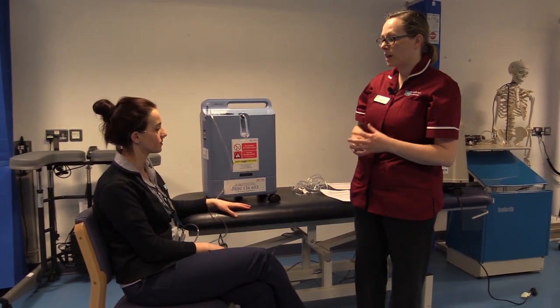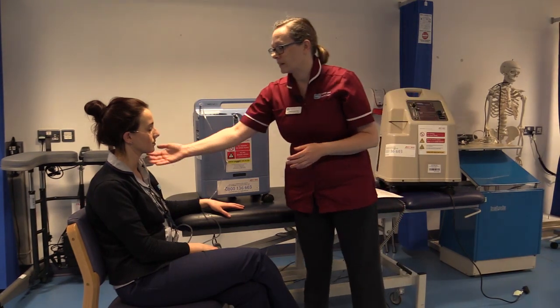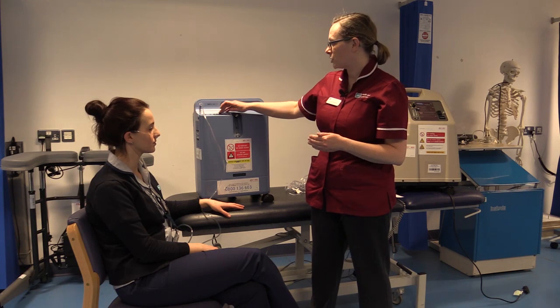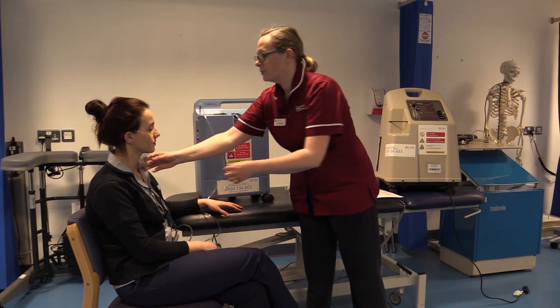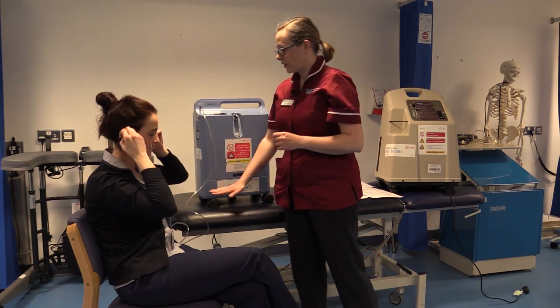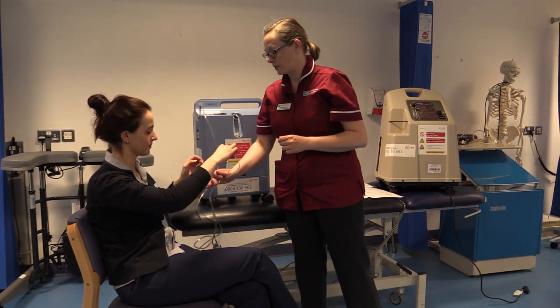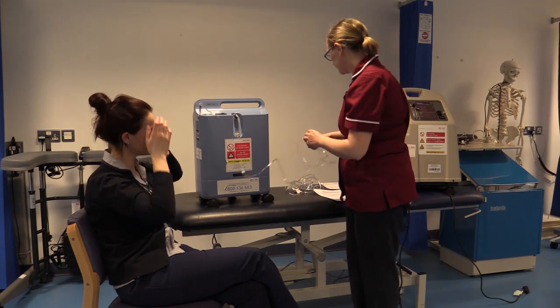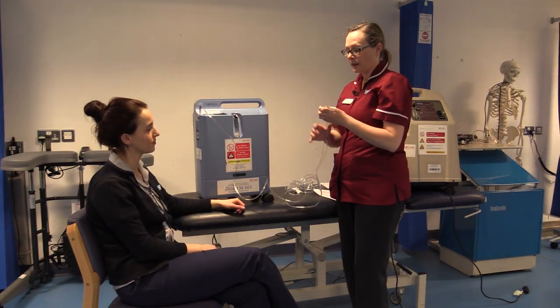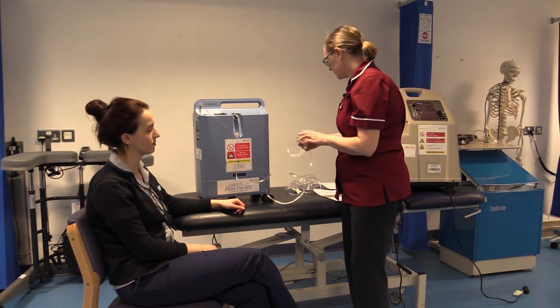Every day these nasal cannula will be changed, and when the patient does not need the oxygen, it must be turned off and then removed. We cannot remove the oxygen and allow the oxygen to sit on top of material while the machine is still turned on. Each day the nasal cannula need cleaned, and each week they need changed.